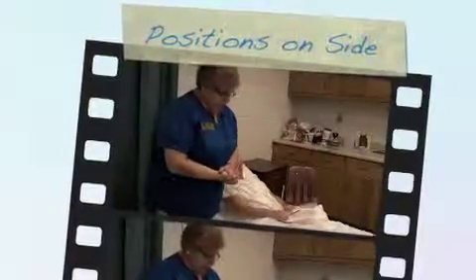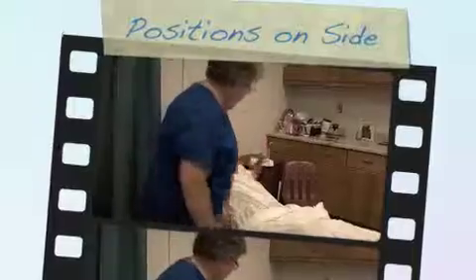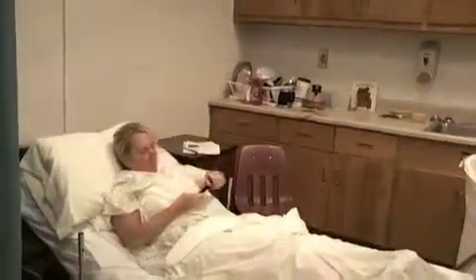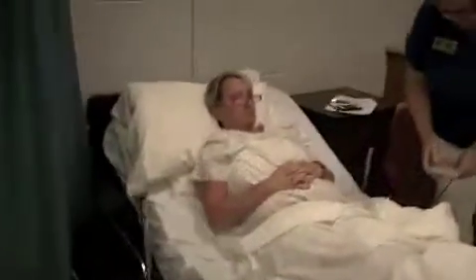Positions on side. Only one you got to use a rail for. Only one. All right. Big controls over here. Move to this side. Sorry, guys. Is the front foot of your bed up, or is it just looking weird?